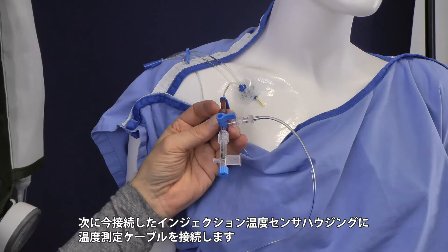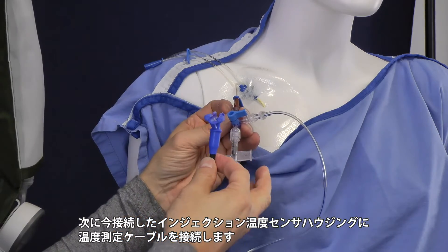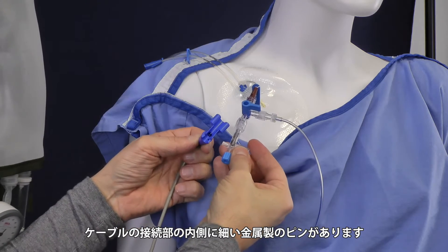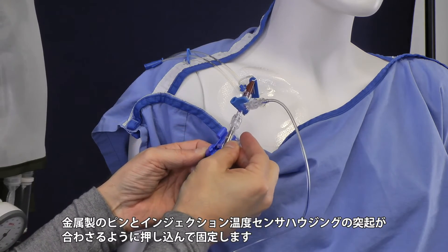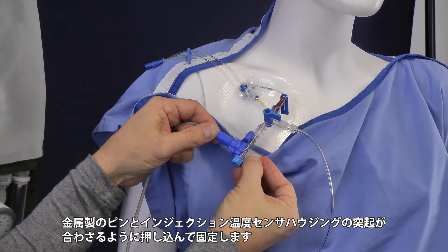What you need to do right now is take the temperature cable from the Pico and place it on the temperature sensor housing. There is a small pin over there. Just make sure it is positioned well and firmly click it together.